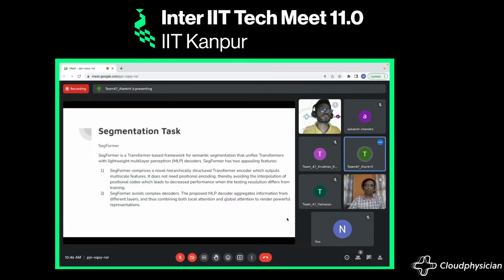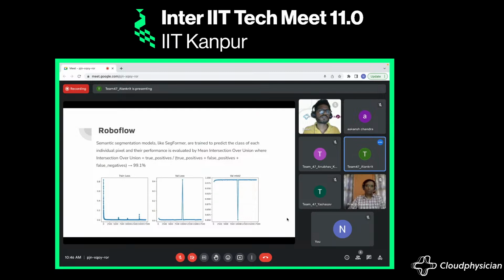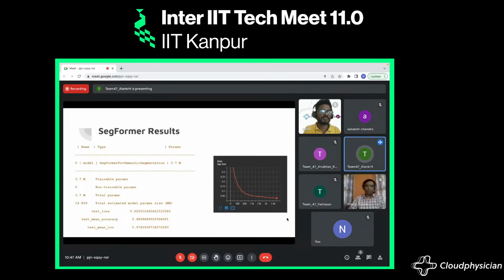First, segmentation. In segmentation we used SegFormer, a library that is used for segmentation. We first trained it ourselves and got approximately 0.98 accuracy, as shown here. But we thought it would be better to train for longer hours, so we went to Roboflow and trained it for about 12 hours to get 99.1% accuracy. So for segmentation we are getting 99.1% accuracy. These graphs are from the Roboflow model, and these were from the SegFormer.